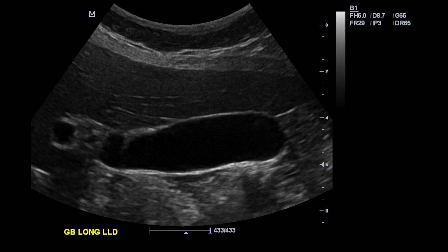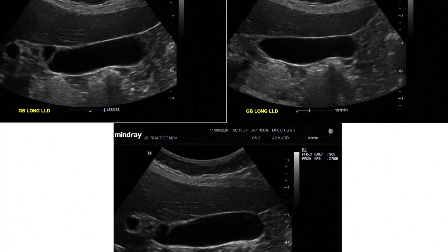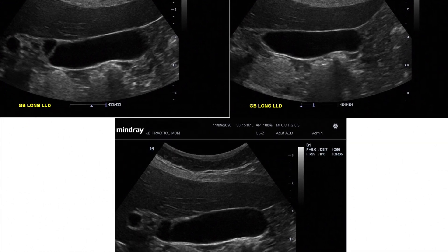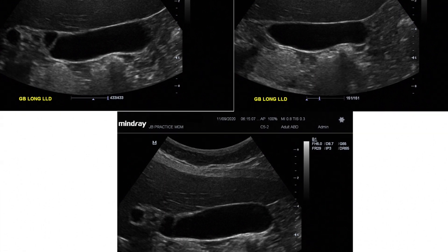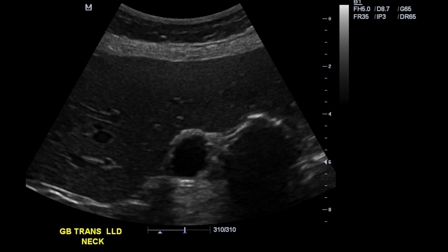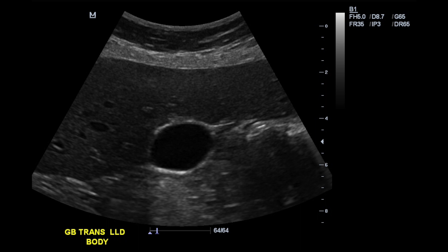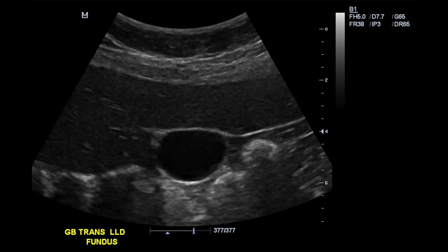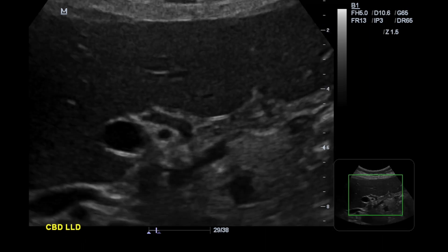Rolling the patient lets you distinguish between stones and polyps: a polyp is actually attached to the internal gallbladder wall and won't move, whereas a stone will roll to be gravity dependent. You can also see a little fold by the gallbladder neck that can fool you into thinking it's a polyp — but if you put color on it, a polyp will have a small feeding artery while a fold won't show any color. You can also look from different angles and elongate the fold to show it connects to both ends of the gallbladder wall. We repeat the same three long images in slightly different planes in LLD — my instructor didn't comment on image similarity this time.